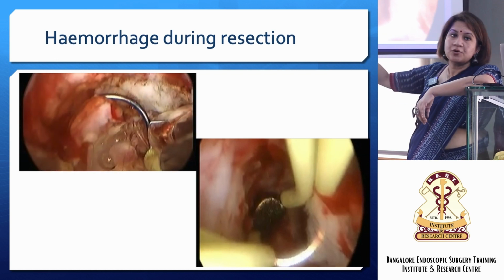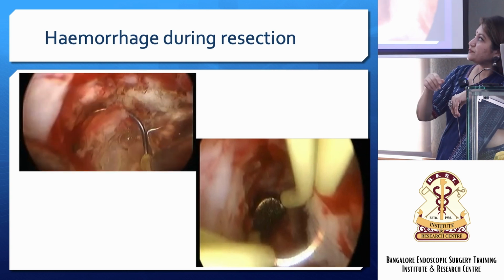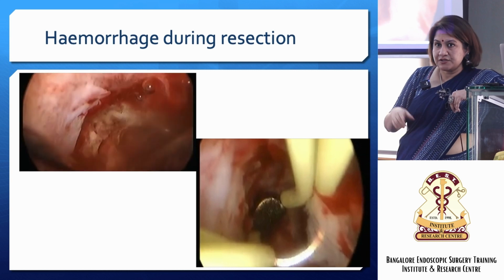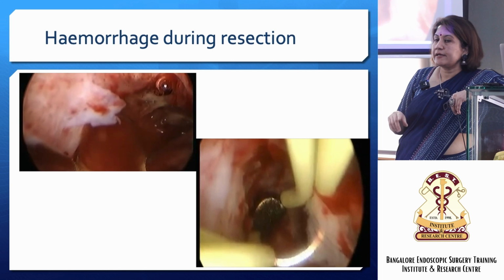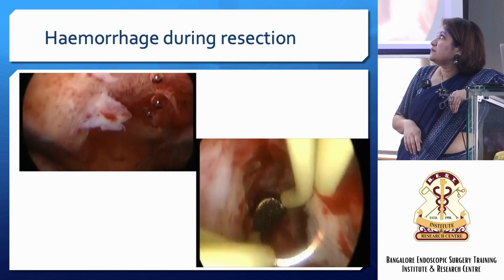And then that bleeding started over there. I think I paused and then continued. In such cases, would it help if we do it under ultrasound guidance? It can. That's what I said. Ultrasound guidance is useful when they are doing Asherman's, and these are cases. But then a sudden spurter started. So, and then I lost the vision also.